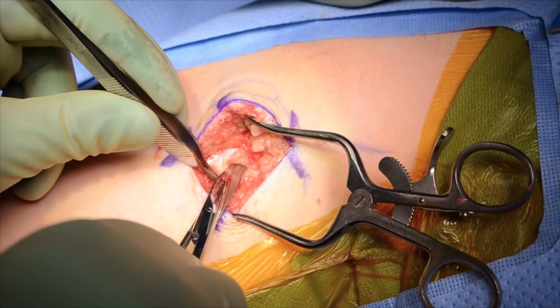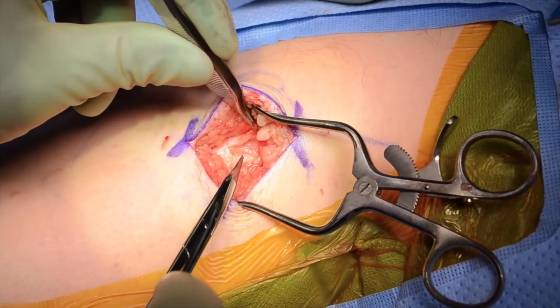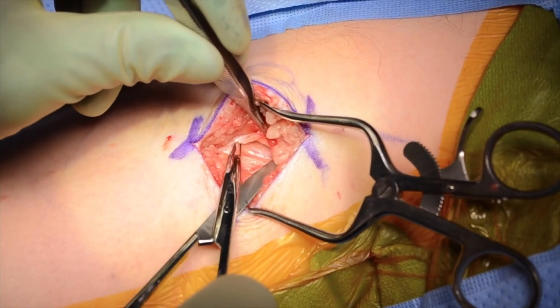Tenotomy scissors are used to circumferentially dissect around the nerve, which is then marked with a blue vessel loop.